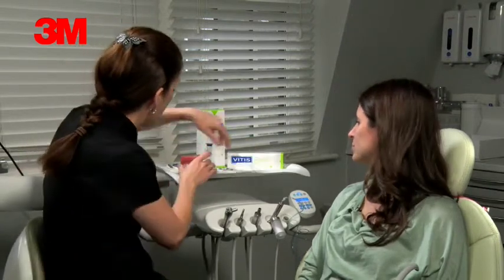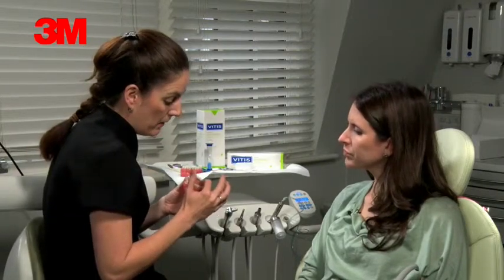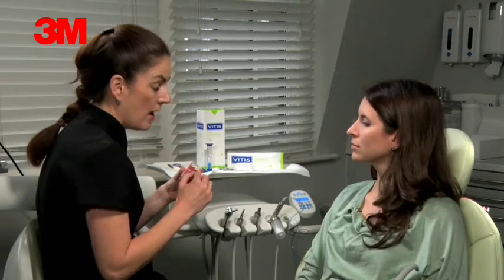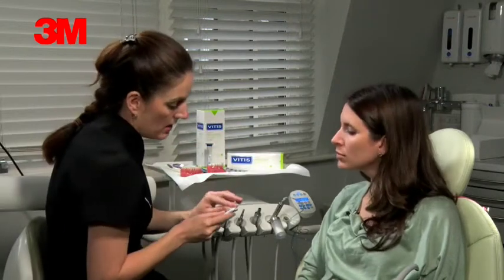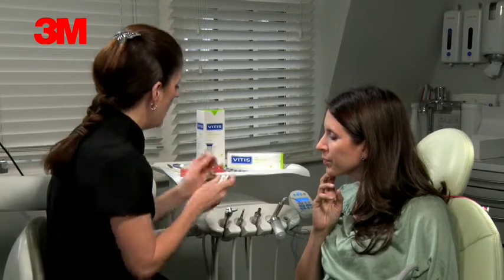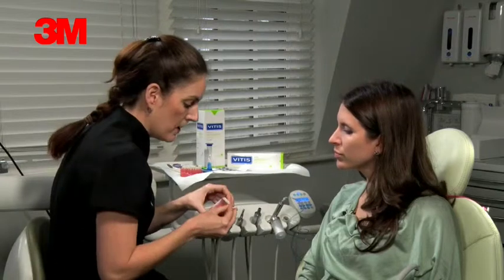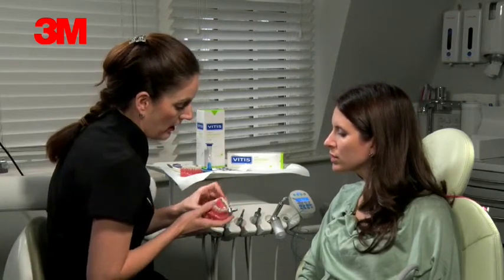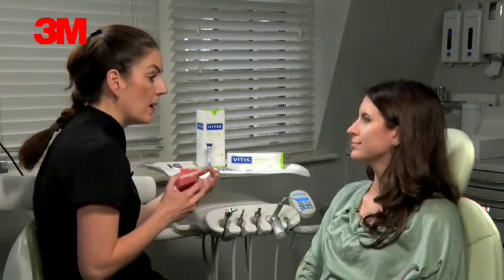You might also find that it might rub. If that does happen, dry the area with a tissue, then take a little bit of the wax — it's just like Play-Doh. Roll it up in a little ball and put it on the area that's rubbing. It just acts like a cushion. The fibres in the mouth will toughen up and then you won't even know the brace is there — like a new pair of shoes, you've got to break them in.